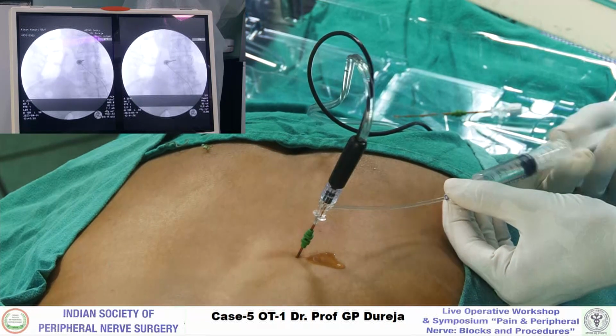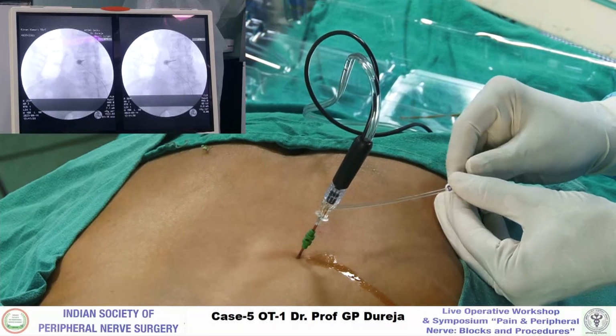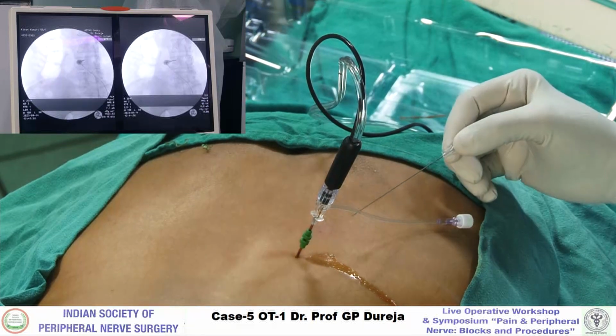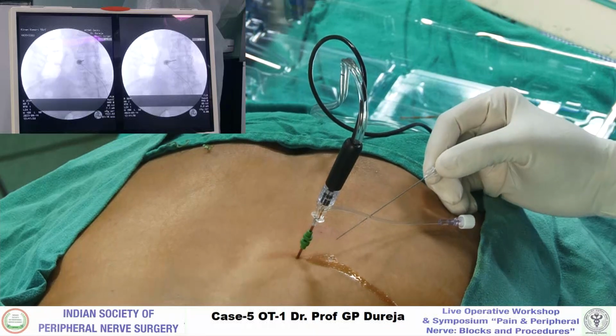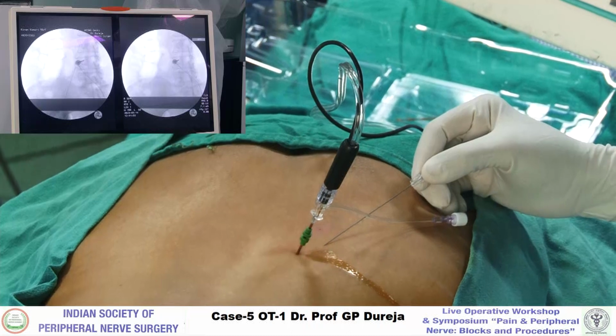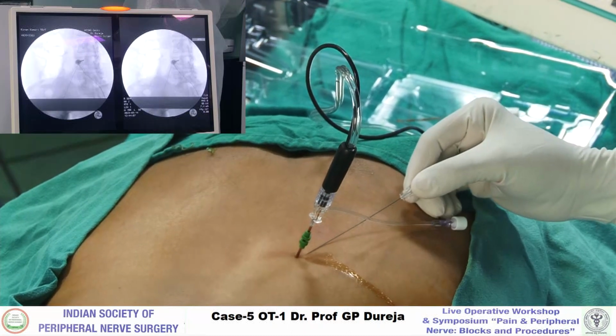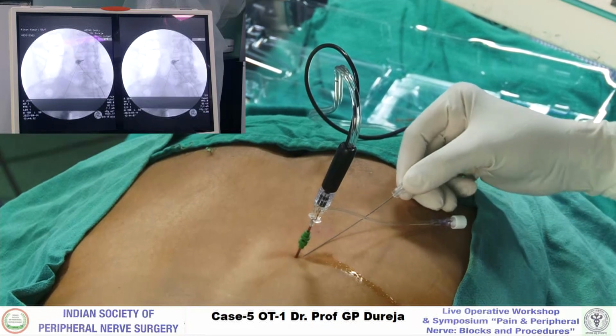ठीक. So till we wait for the local to show the effect, I'll just tell you that you have to go. इस यहाँ पे आ रहा है. दिखाइए सर. हाँ, yes sir, we can see. So you have to go a segment below. Right, sir. And then your needle has to be just parallel to the bone. Okay, okay, sir.